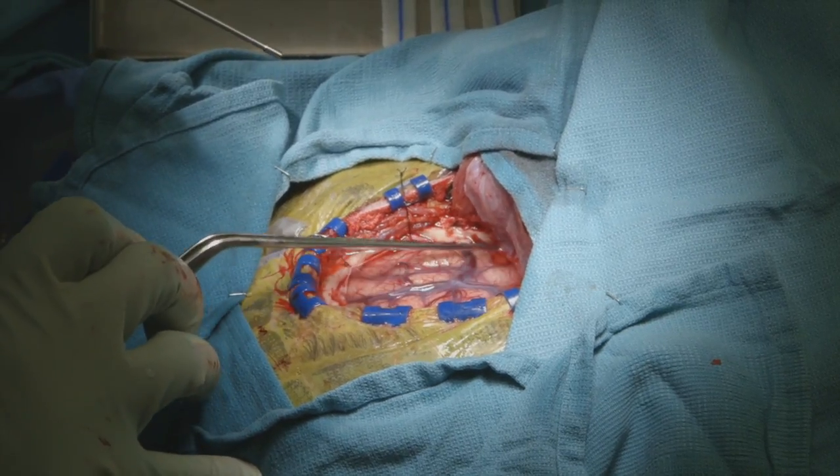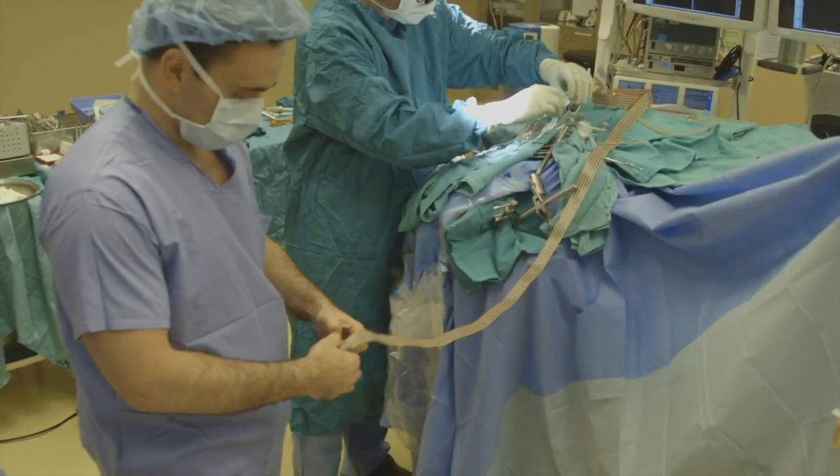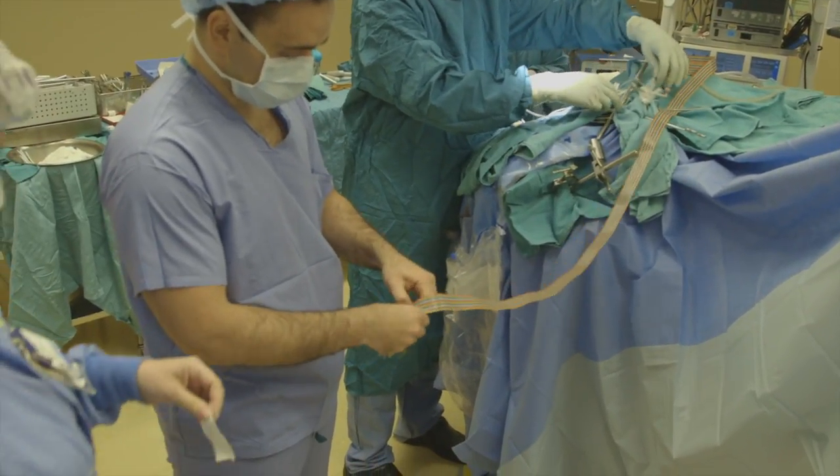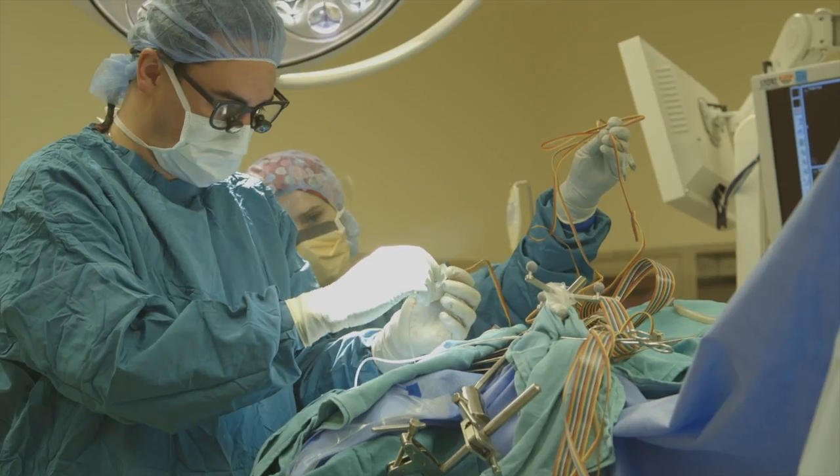That lets us look at her brain. There's the left temporal lobe. From here this way is the left frontal lobe. And then we lay these little sheets of plastic that have little metal electrodes embedded in them — about as thin as a sheet of paper.